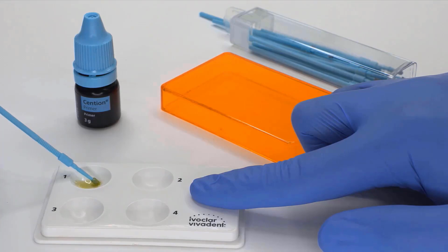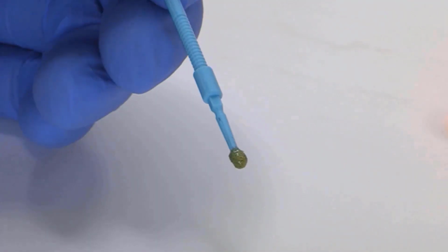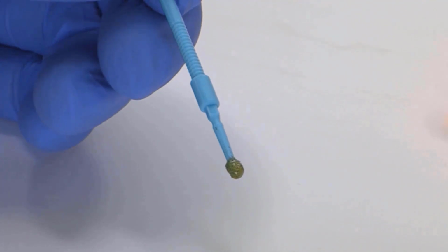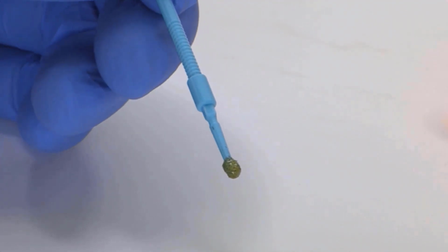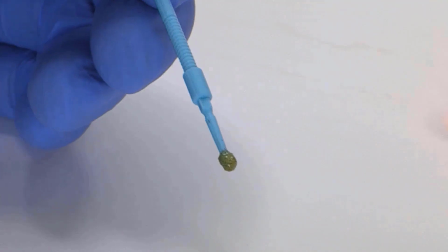Ensure that the flocked brush, which is coated with the catalyst, is fully covered with the primer, as you can see here with the uniform yellow color. The primer is activated upon contact with the catalyst on the brush and the Cention Primer liquid. Therefore, the primer must be used within 120 seconds of mixing.